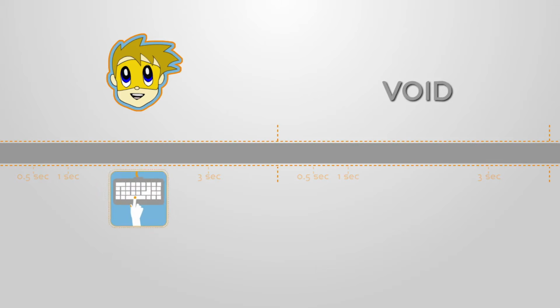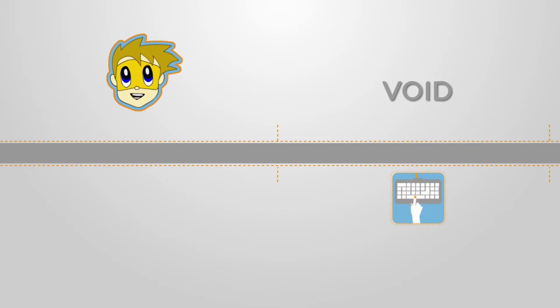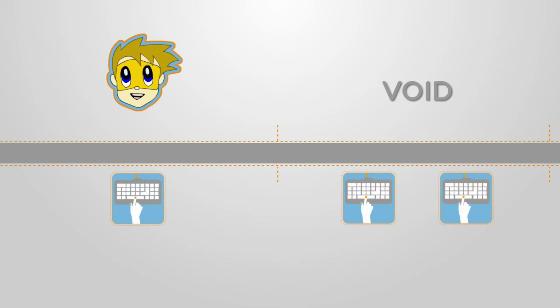If the patient presses a key while the target element is still on the screen, it will be categorized as correct attentiveness and correct timeliness. If the key is pressed after the target element disappears, during the void that follows, it will be categorized only as correct attentiveness.